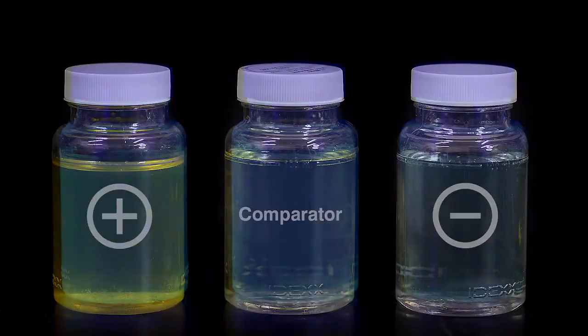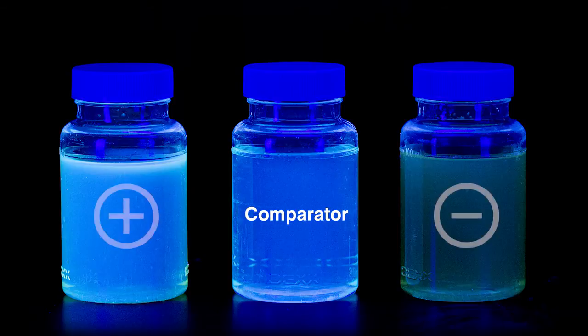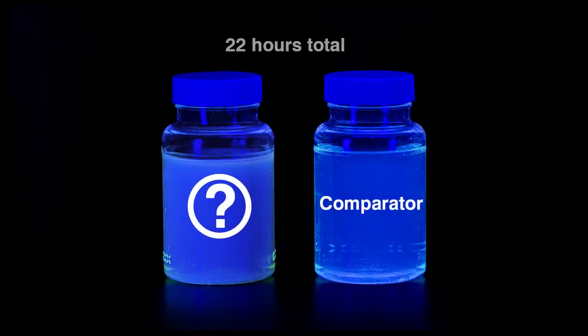If the sample is yellow, determine E. coli results by shining an ultraviolet lamp on the sample in a dark environment, shining the light away from your eyes. Keep the light within 5 inches of the vessel. If the sample is yellow and has fluorescence equal to or greater than the comparator, the sample is positive for E. coli. If you're unsure whether a result is positive, incubate the sample up to an additional 4 hours — 22 hours total — to allow the color and/or the fluorescence to intensify.